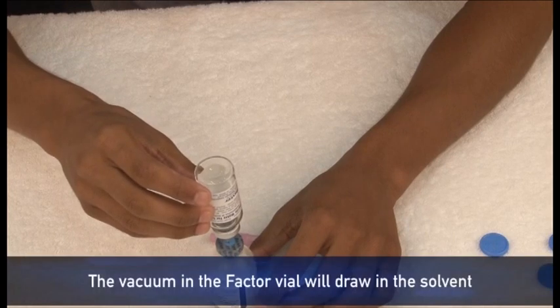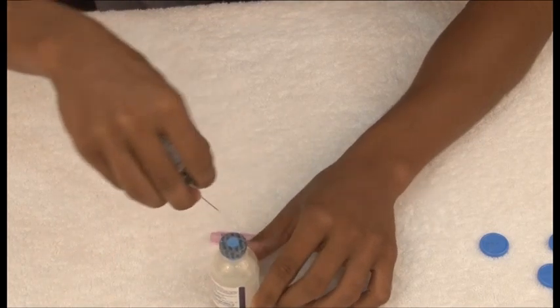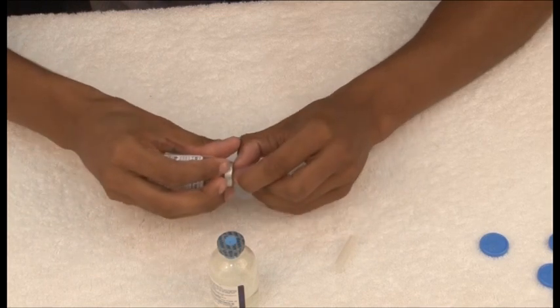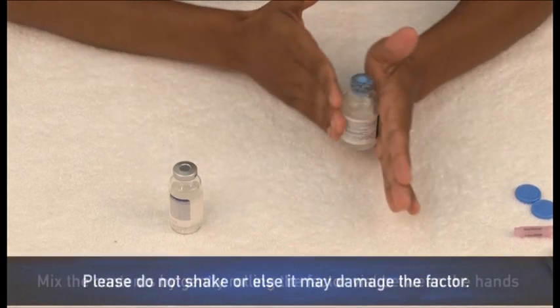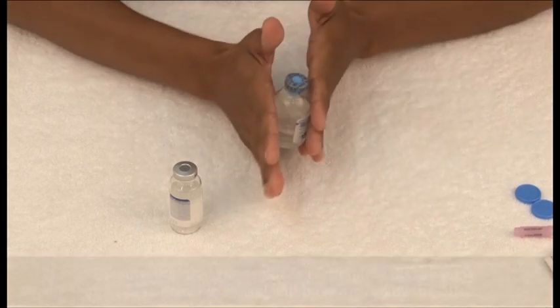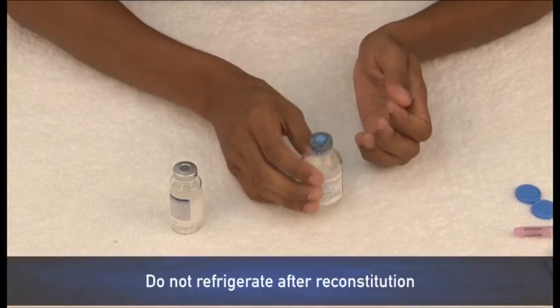The water will flow from the diluent vial into the factor vial. Once the diluent vial has drained, remove the double-ended needle. Mix the contents by gently rolling the factor vial between the hands. Swirl gently until all material is dissolved and the solution is clear. This is the reconstituted factor.